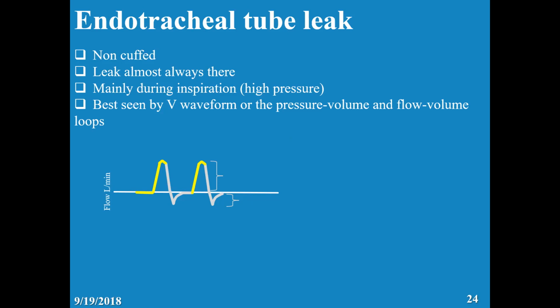So principle one: the flow always has to come back to zero. Principle two: the in has to equal the out. The above has to equal the below. The positive has to equal the negative. Is that clear? So whenever it's not equal, if the flow in is less than out, the out is more than the flow in. Where is this out coming from? It should be received from somewhere.